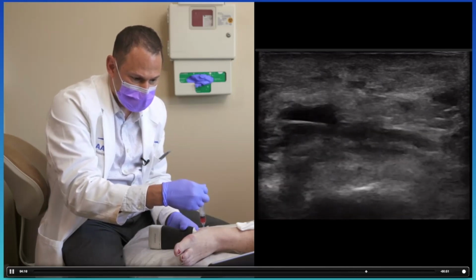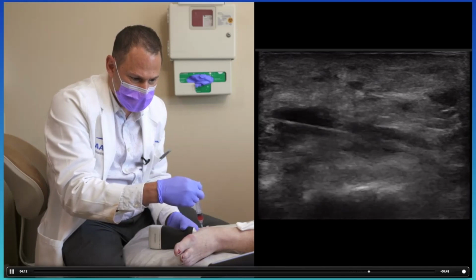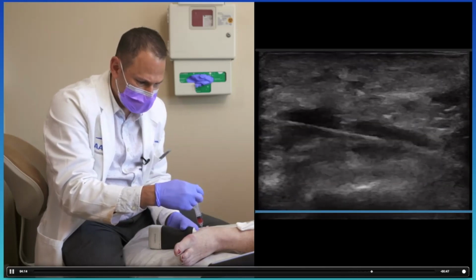And you may be a little sore here after, but it's going really well. Nice and smooth. This is the way it should feel.